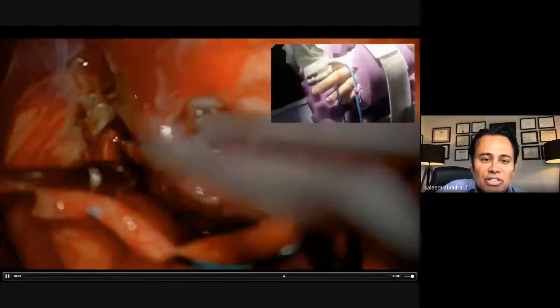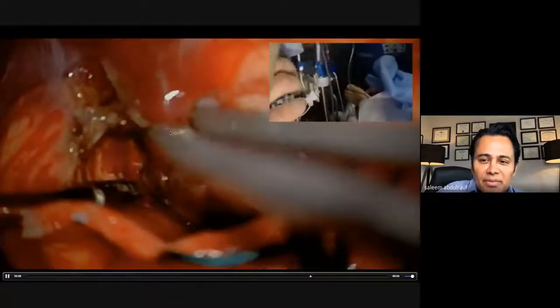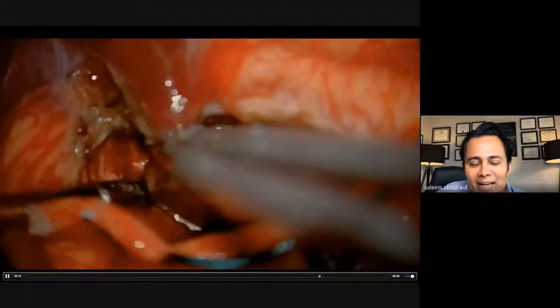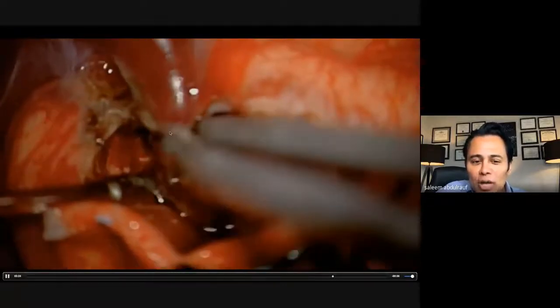You see, because it's internal capsule, we're checking the leg. So I am knowing 100%. I'm checking as I'm closing that vein. She's cooperating very well. You see, it's the comfort I have in doing a case like this because I know 100% every step of the way what outcome issues I'm dealing with.